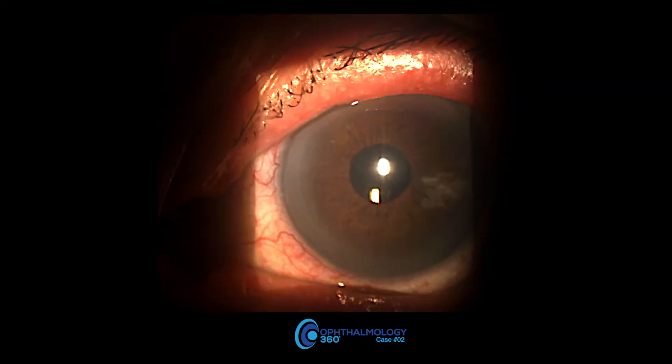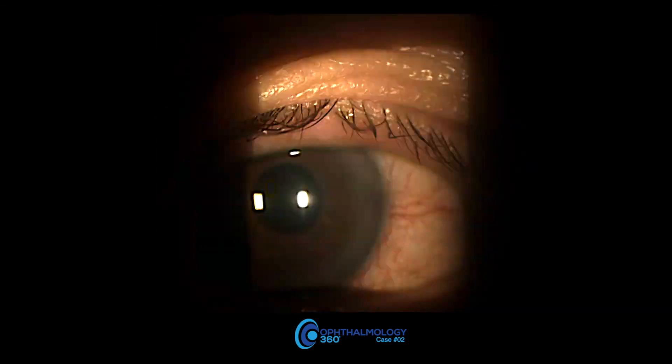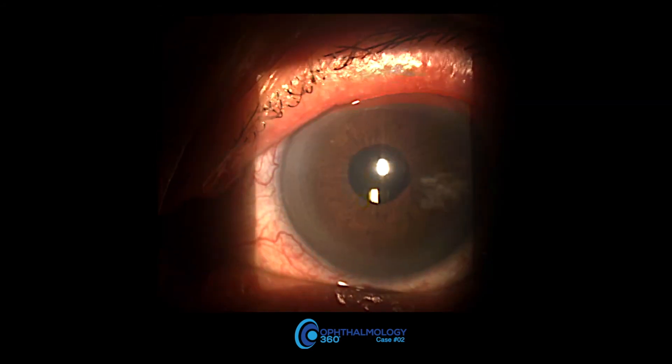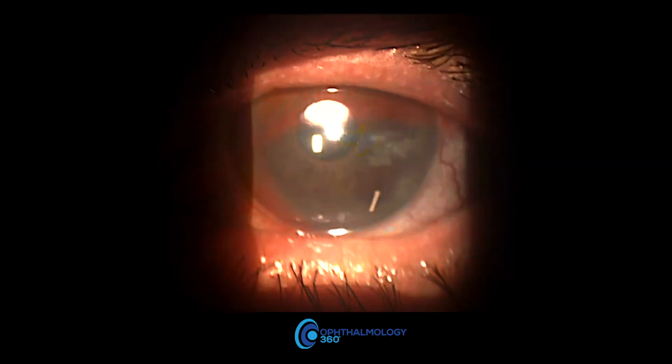You can't always control the depth — sometimes when I first started, I was going a little bit deeper, but two bevel lengths usually get you in there pretty smoothly. These are done at the slit lamp. You can do them supine as well. I don't use a speculum — I think the patients are much more comfortable that way.